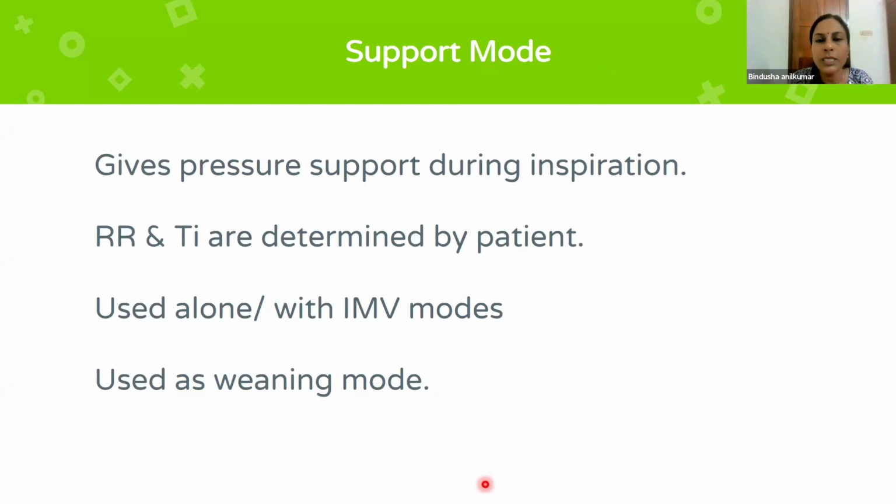Okay. Just know that the pressure support mode can be used during the weaning period, and also in some of the patients requiring prolonged ventilation, we may use it for a longer time. Otherwise, it's never used as the initial mode of ventilation.